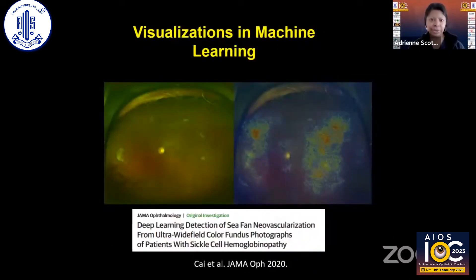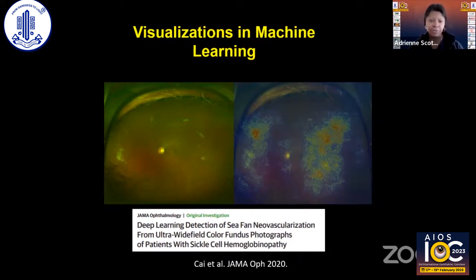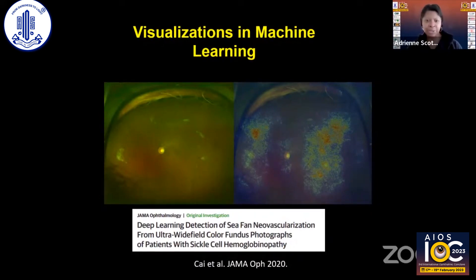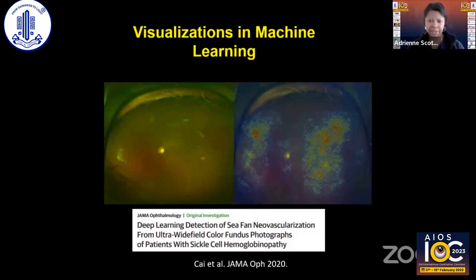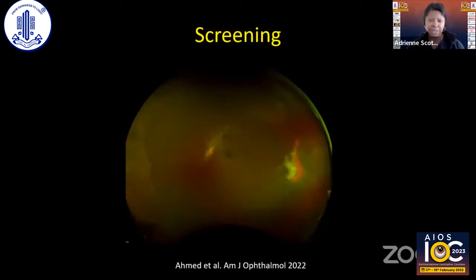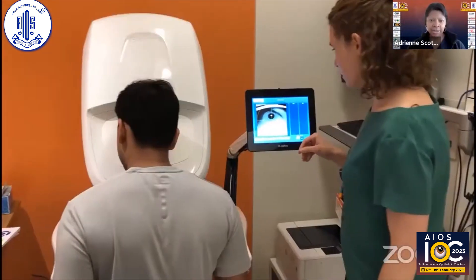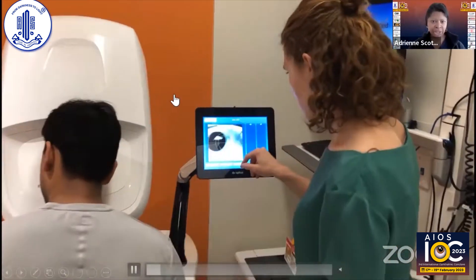Ultra-wide field imaging is super helpful. We used it to work with the computer science team at Johns Hopkins to identify sea fan neovascularization in sickle cell disease. You can see ultra-wide field images of patients with fibrosis or auto-infarcted sea fan lesions on the left. A heat map was created after training a neural network to teach the computer to identify what is suspicious for sea fan — where the heat map is red, the computer is detecting a possible sea fan forming. We also used this for screening for sickle retinopathy.